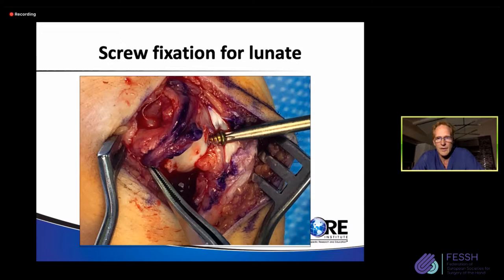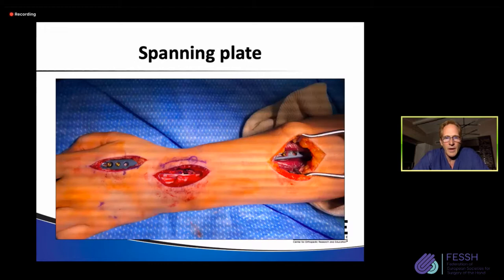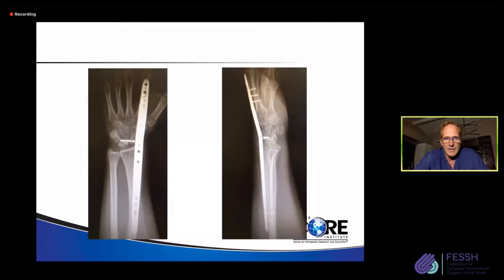We felt that was going to be the best way to secure the small bits of the lunate. And so then we put our spanning plate with appropriate tension, and that is our post-op x-ray here. And we thought we were doing pretty well.